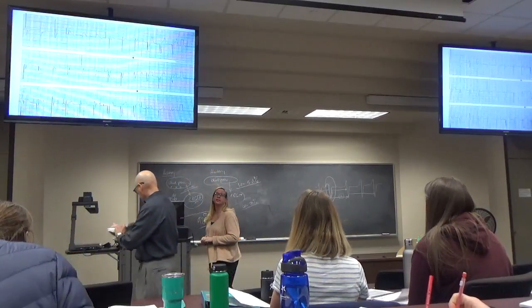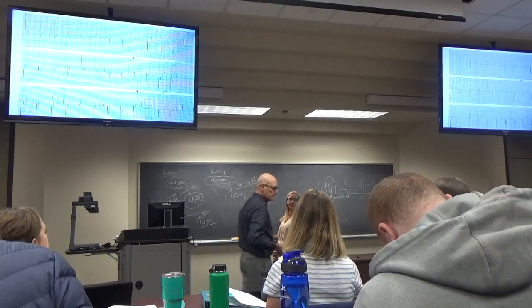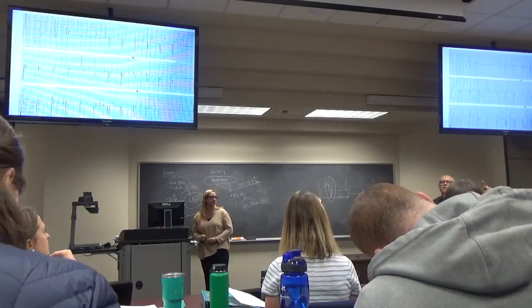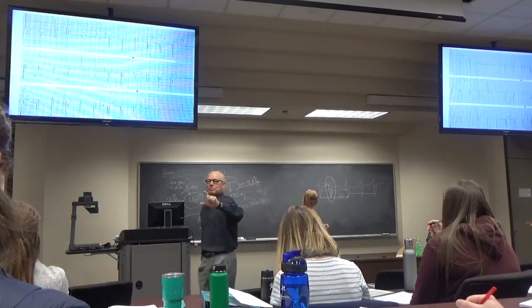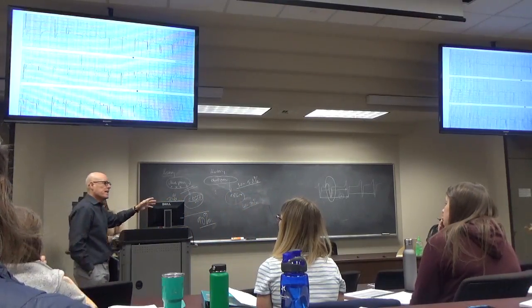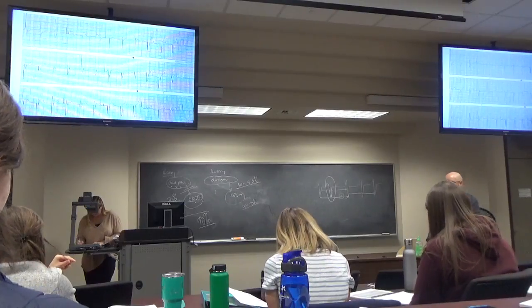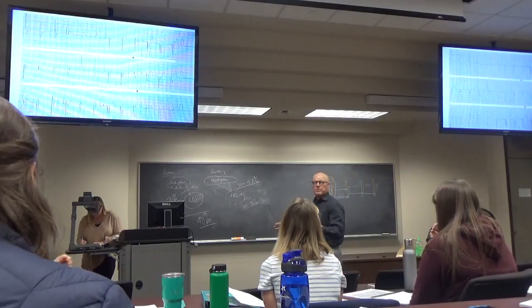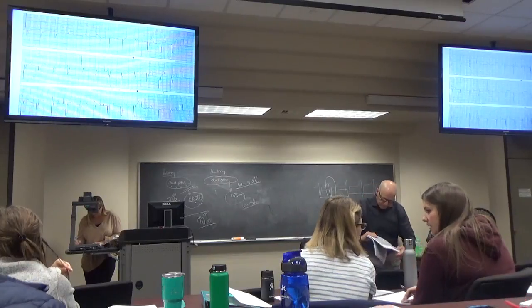Are the new pacemakers allowed for you to put a magnet and be... Yeah, so the key for you is to recognize when the EKG is showing you a pacemaker. Now, there are also new pacemakers where the atria and the ventricle are being paced. It's a two-chamber pacemaker. So you'll see a little spike before the P wave, and a little spike before the QRS. What Tammy is saying is that they can come in and put a magnet on the patient's chest, shut the thing off, and see what the natural rhythm is. They can also change the battery if it's too low. All right. 16.